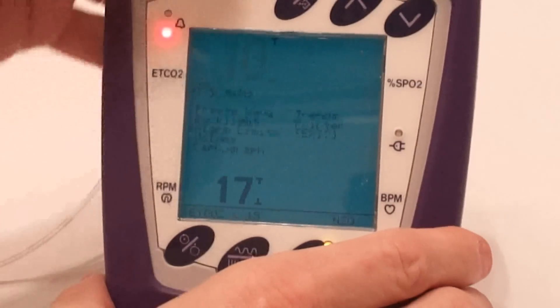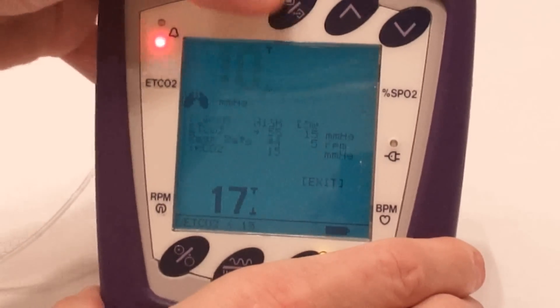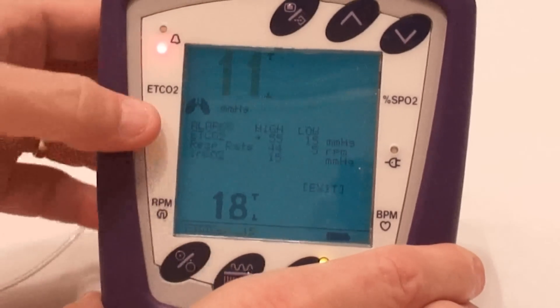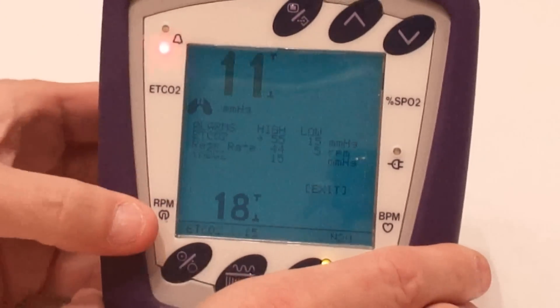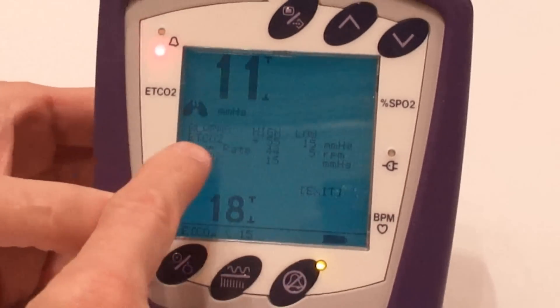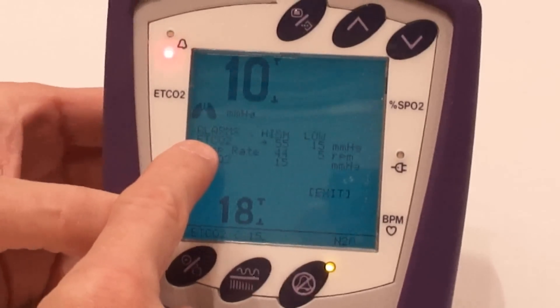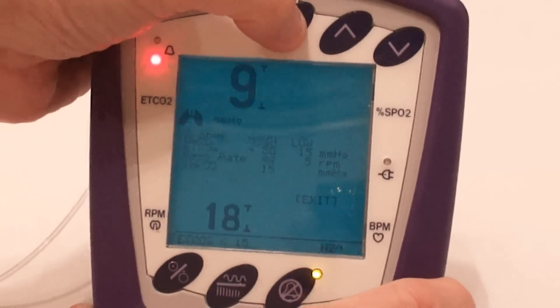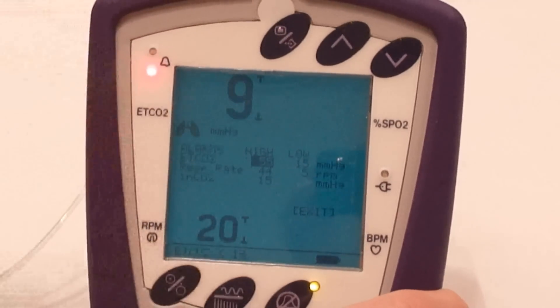For instance, we'll look at the alarm limits. Press the menu button again and here comes up your alarm limits. So what we do is right now we have the alarm set on end-tidal CO2. High is at 55. If we wanted to change that, we would just press the menu button and it highlights it.